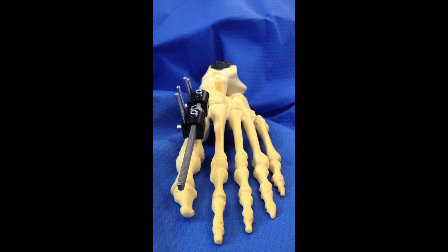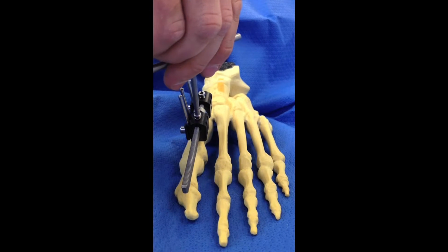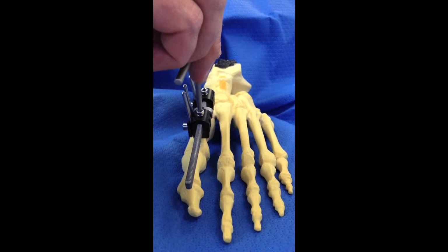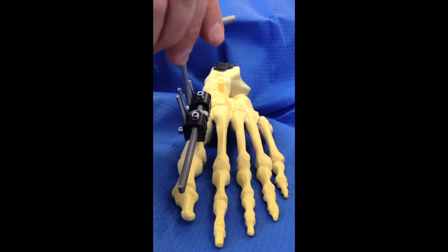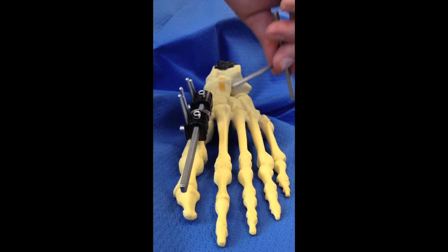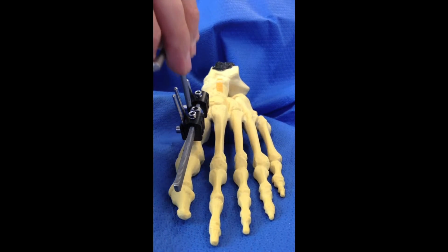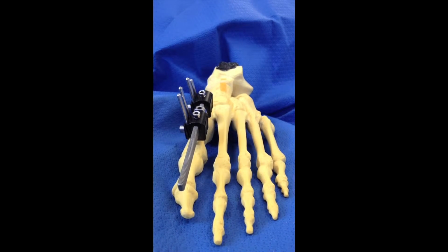Here's that same adjustment from another angle. We're going to put the wrench inside the set screw, turn counterclockwise to loosen it. We're going to find the nut, rotate 90 degrees, go back in the set screw and lock it. We'll come back later that day, same process, unlock the set screw, find a spot for the wrench, turn 90 degrees, and then lock that set screw again. That will be your 2 adjustments separated by about 12 hours.